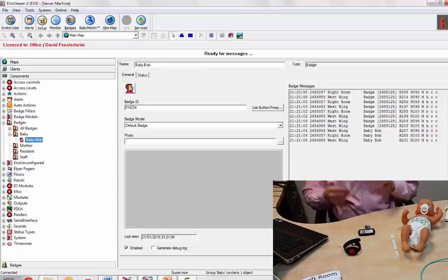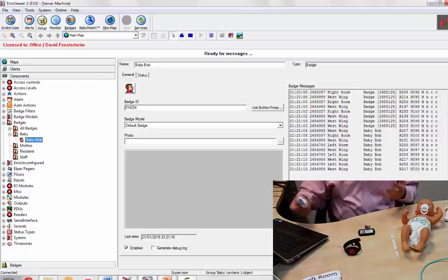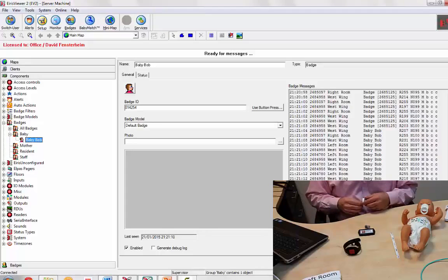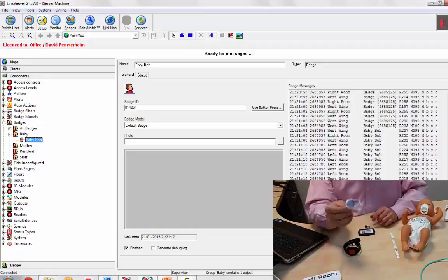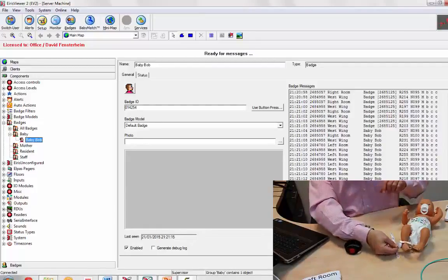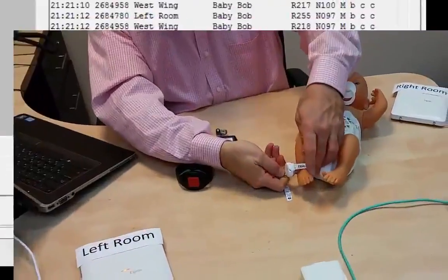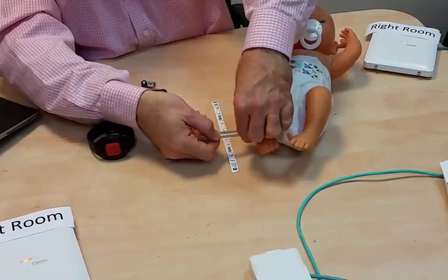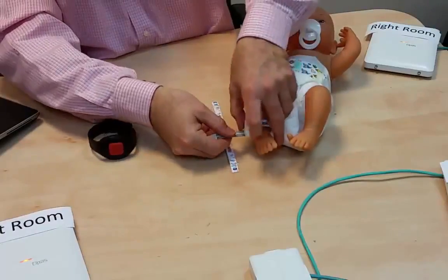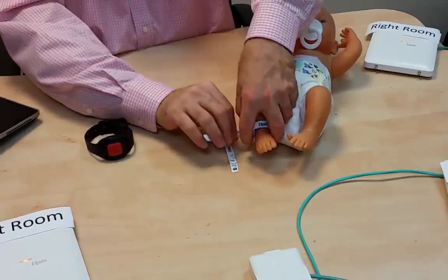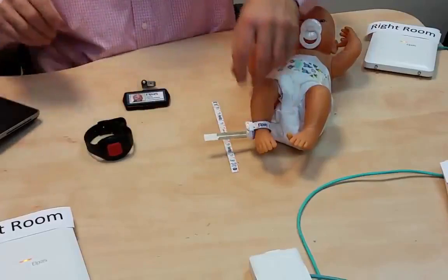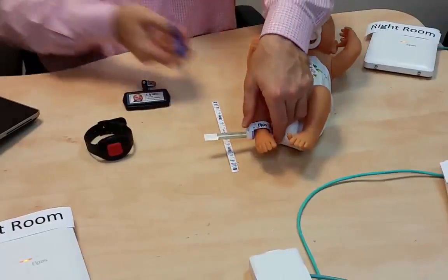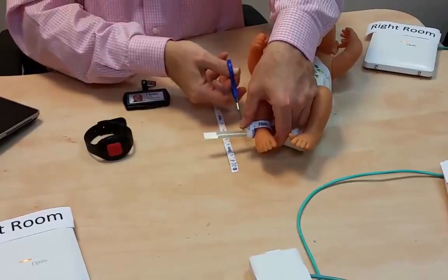You can have the tags enrolled in advance and not need to enter names. We're now going to attach the tag to the infant foot. Tighten it until it's kind of snug. And then, of course, snip the excess.